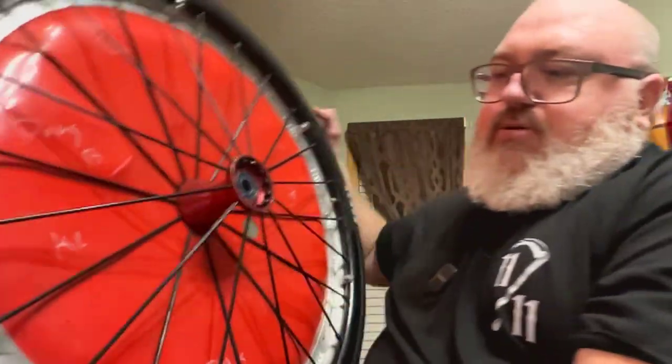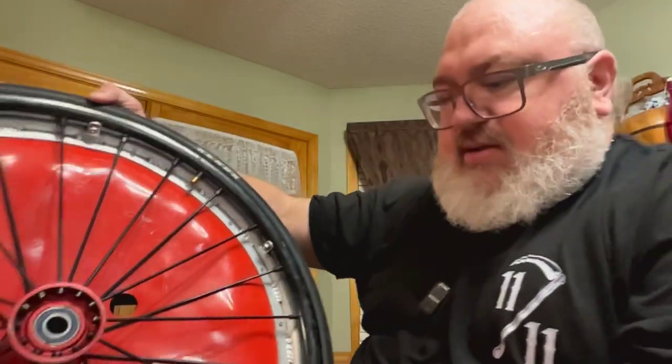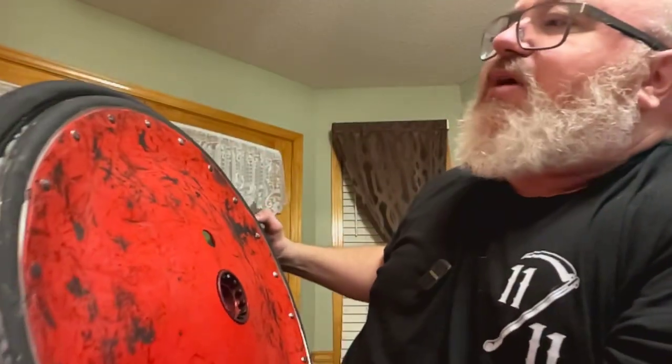All right, so we have a tire change. 10 minutes, 14 minutes. So that's kind of what I end up doing. I sat and rushed a little bit, but honestly, I'm not fatigued. I'm not stressing that I'm trying to get to the next game. So it went by a lot quicker. Tire changes are one of those things that's a learned thing. The more you do it, the better off you are.